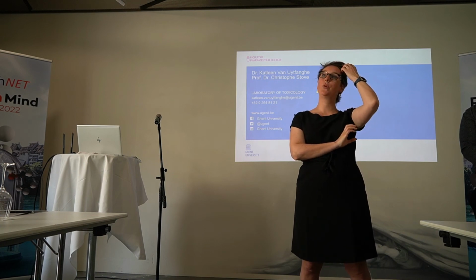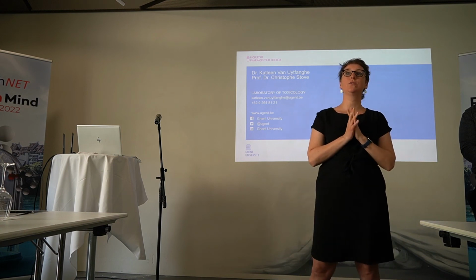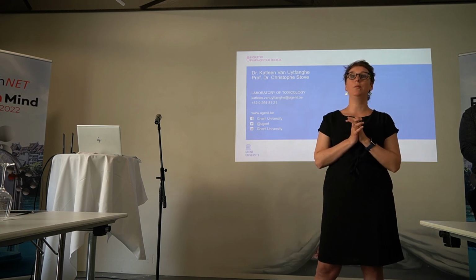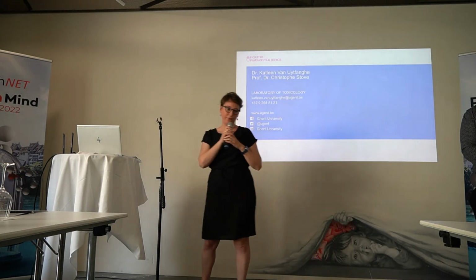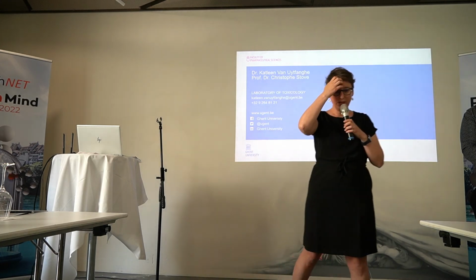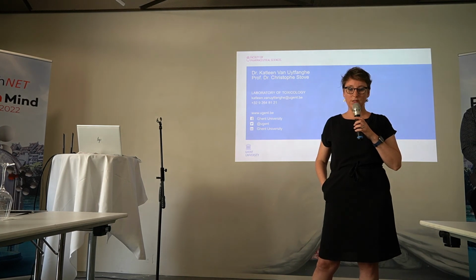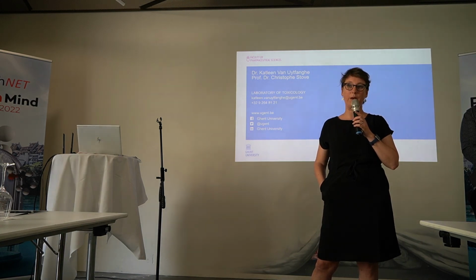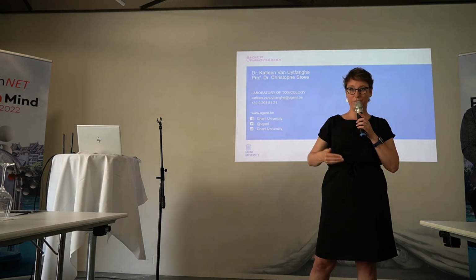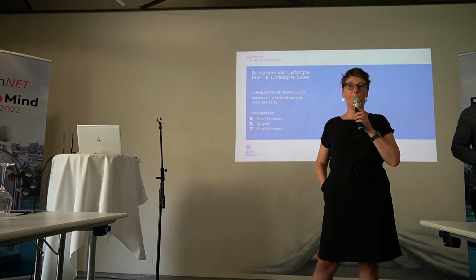Well, I suppose if you have ISO accreditation for a method, you are required, according to ISO 17025, to document validity of results, and then you have a list of things you can do, and one of these things is interlaboratory comparisons.